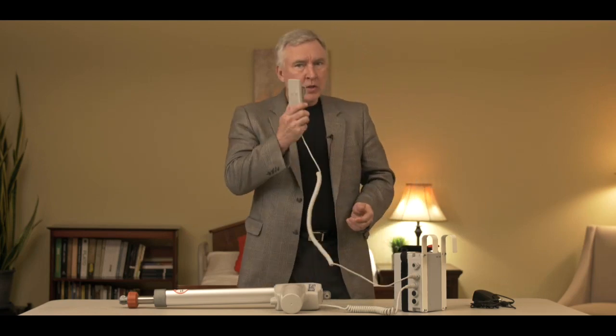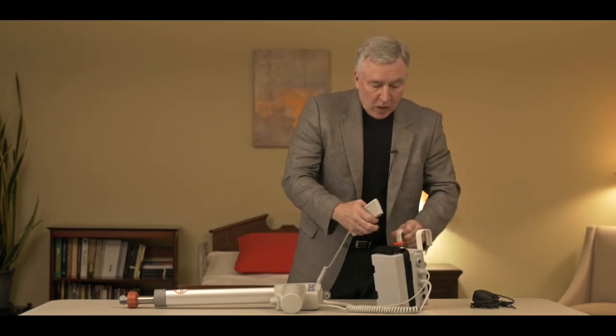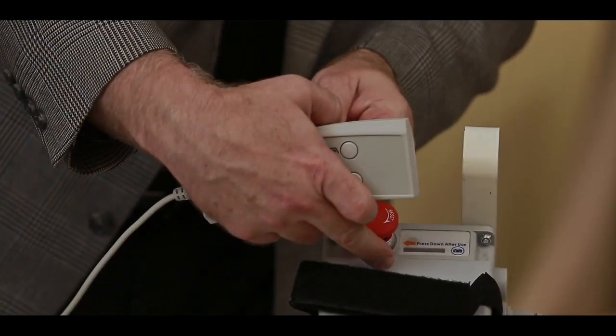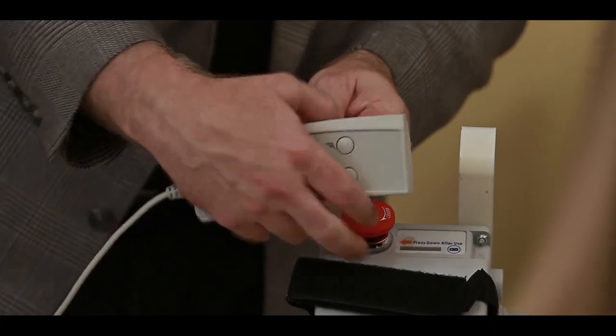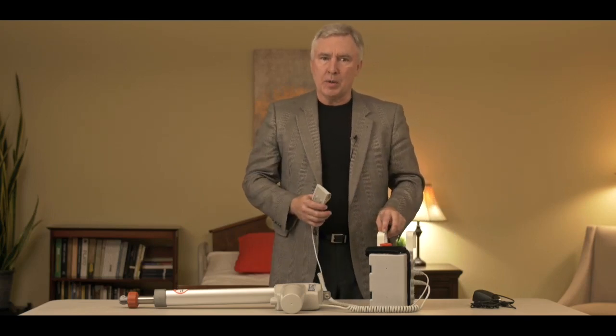The first thing to check would be the hand control. If you're pushing the up and down buttons and the light at the top that shows when it's charging doesn't light up — just like it did before when you had it plugged in — and you don't see those lights come on, then the chances are you have a bad hand control. Now if you replace the hand control and the lights still don't show up, then more than likely you have a bad PCB on the unit, which I'll be showing you a little bit later.